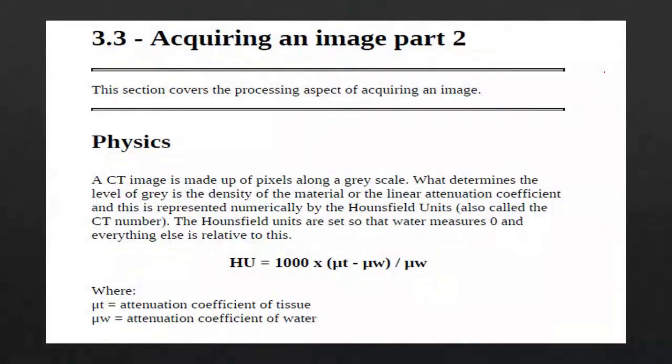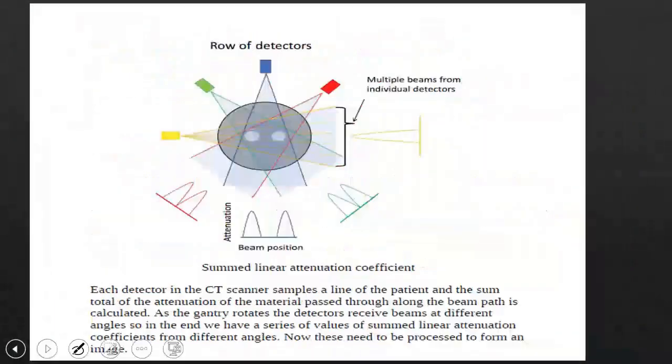The Hounsfield unit comes from the biomedical engineer who was around in 1972, meaning the equation that expresses the CT number that we use and that you all use in measurements every day. The Hounsfield unit is about what? It is about the difference in attenuation. So I am now simplifying it.